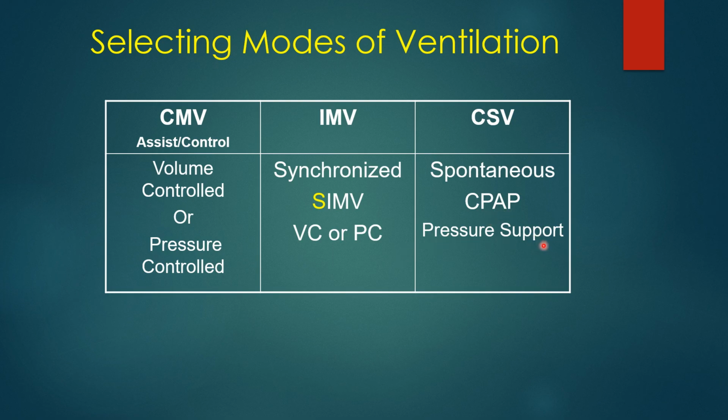Pressure support is not a mode, although you'll have ventilators that'll have mode and you select pressure support. And a lot of people will tell you, yeah, he's in the pressure support mode. Well, I don't go around correcting people when they say that. It's not useful, and you can irritate a lot of people by correcting everybody on all this. I know what they mean when they say he's in a pressure support mode. He's in a spontaneous breathing mode.